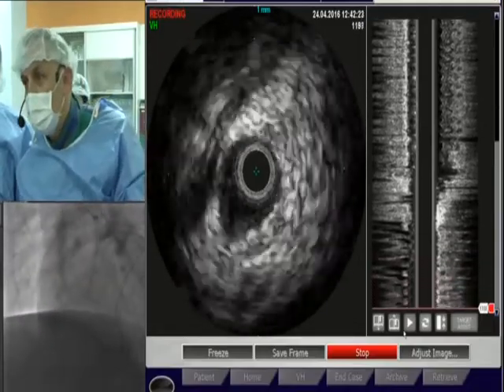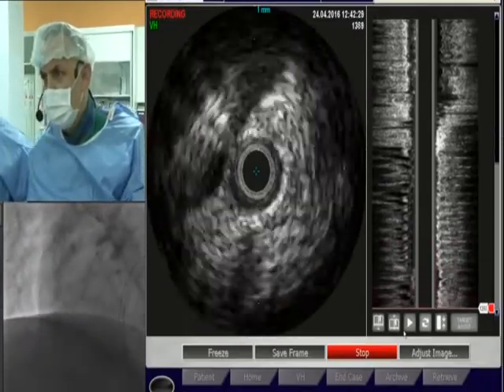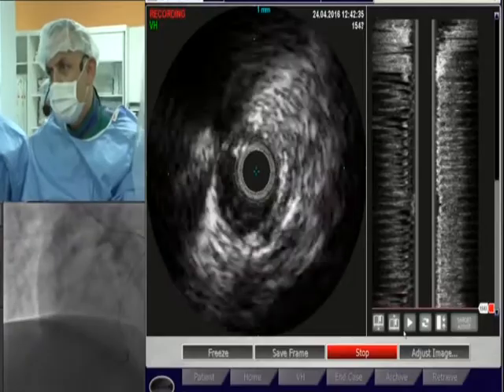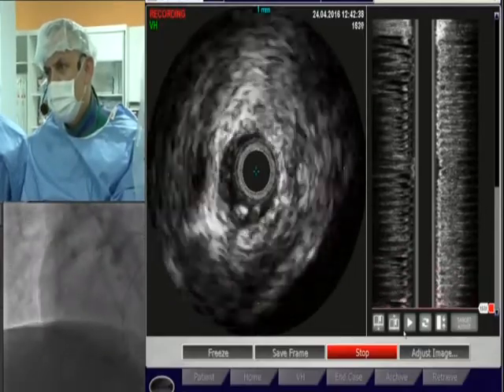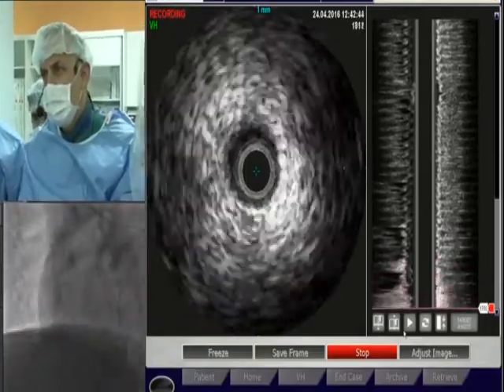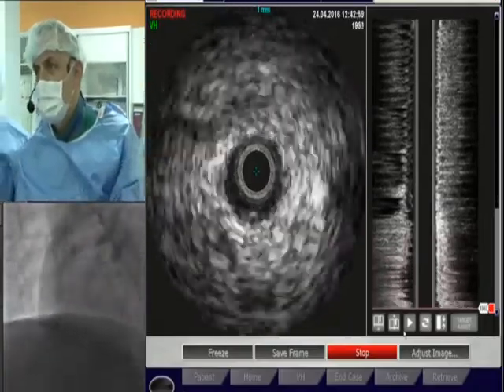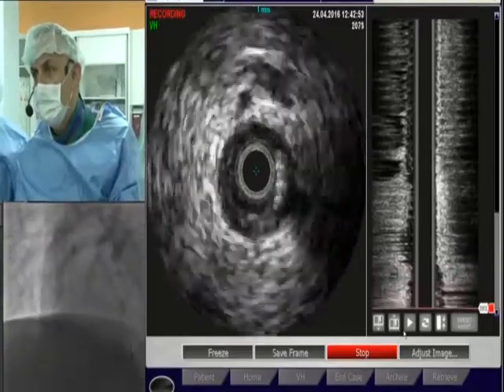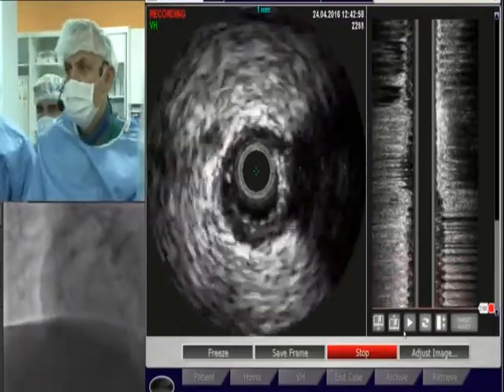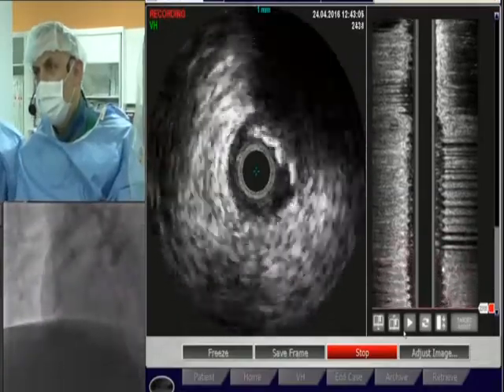Okay, now in here, the vessel looks not bad. There is some diseased part here. The size of the vessel is around 3, actually 3.0, 2.8, 3.0. And I come back to the bit. Now my wire is in the intima, in the true lumen, you see. There is a very calcified lesion, which is from 3 to 7. And I come back. I'm still in the true lumen.